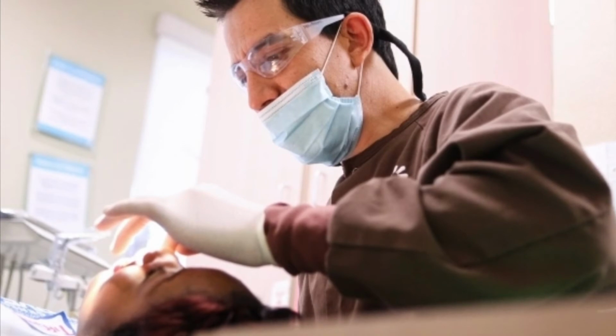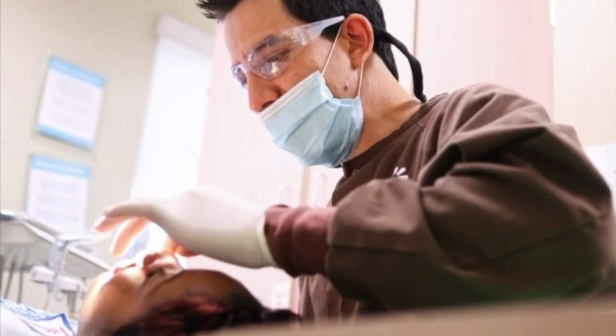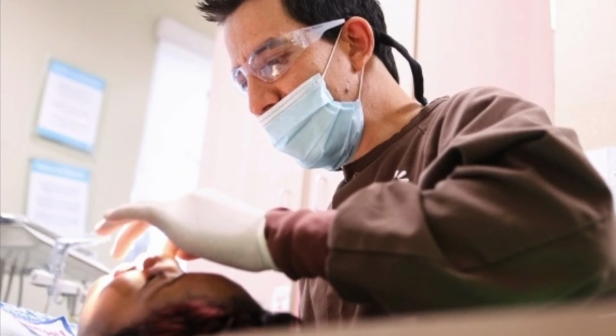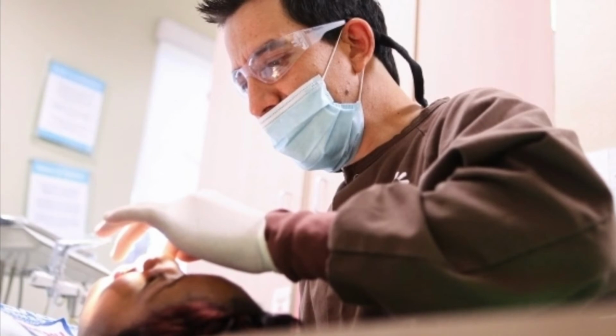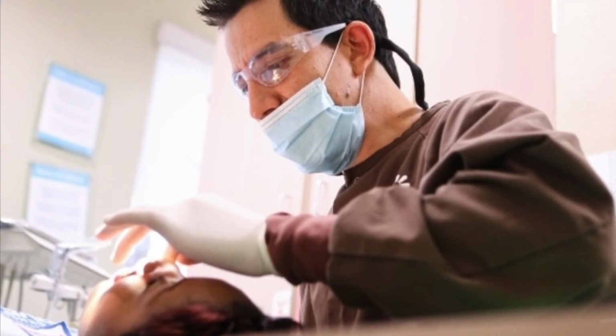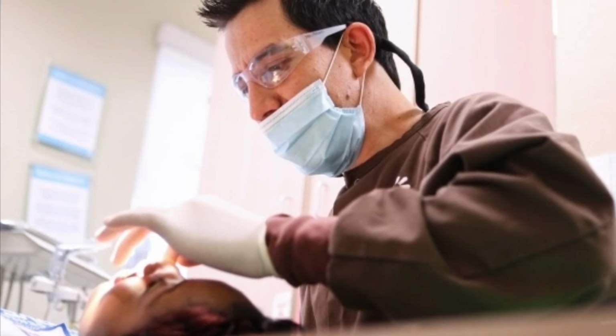Again, some people say, what if the radiograph results are too long? And the answer is, if the radiograph results are too long, for example 3 mm long, we have to subtract 4 mm and take another radiograph. If the radiograph results are too short, for example 3 mm short, we have to add 2 mm, then take another radiograph.